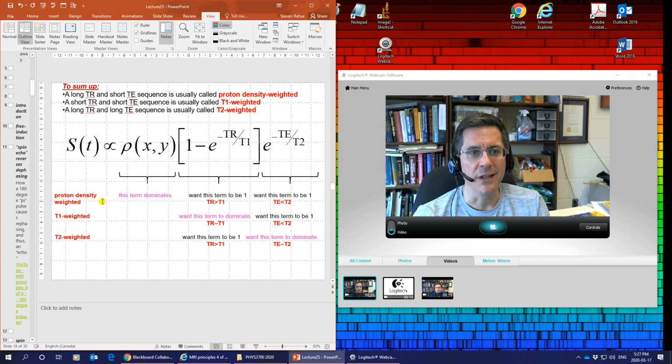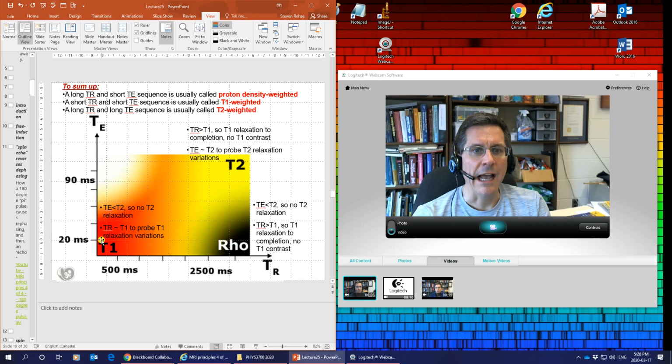So I do need you, coming out of this lecture, to know what a proton density weighted sequence is. I need you to know what a T1 weighted sequence is. And I need you to know what a T2 weighted sequence is. I need you to know what TR is and what TE is. And I need you to know how you pick TR and TE to get those different sequences.